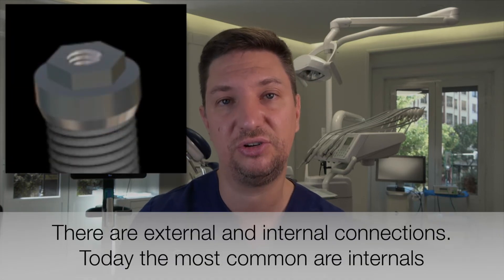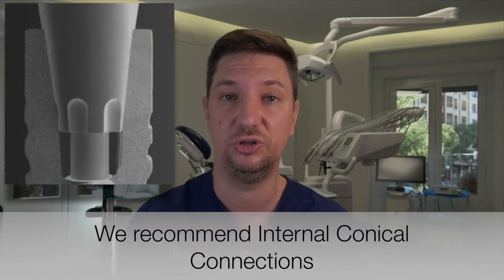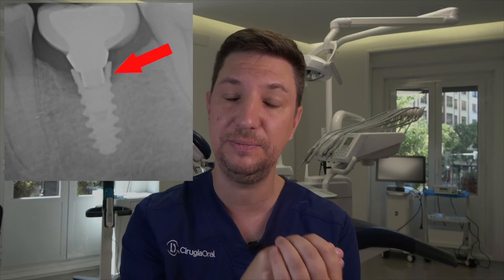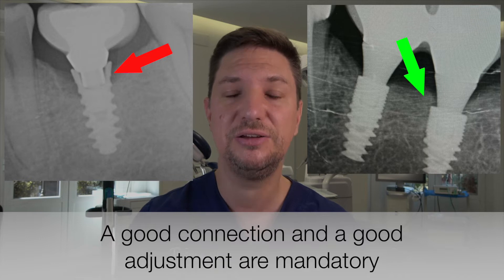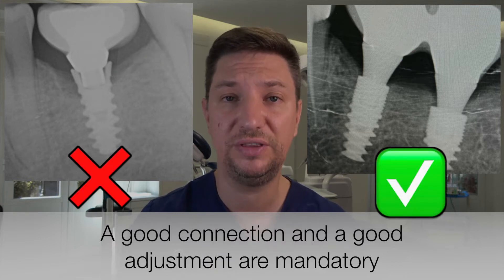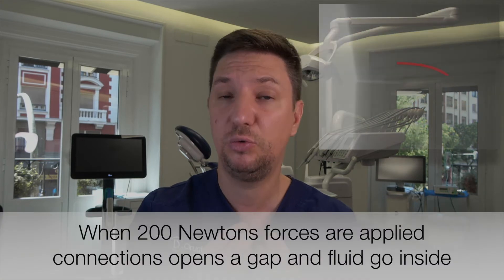The second reason is when we use a poor connection. We used to use hexagonal external connections in the past, which are not very good. Now we are using internal connections. The best connection nowadays is the internal conical connection. They have such great adaptation to the implant that we have no gap at all between the implant and the abutment. Having a good connection is really important. In this video we can see how the connection moves when we apply a lot of forces on one side — that is what happens when we don't have a good connection.